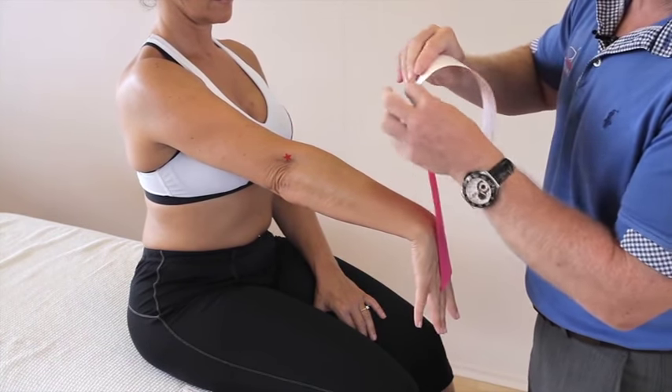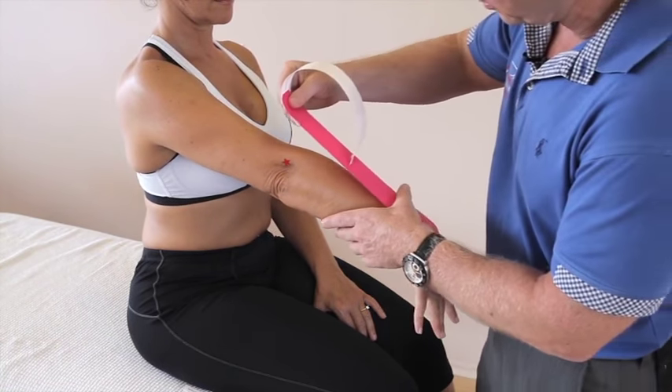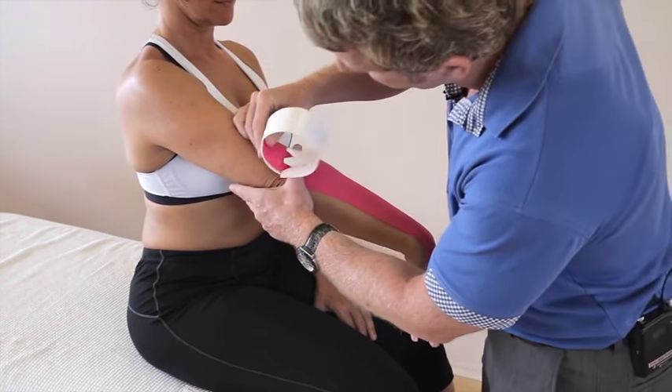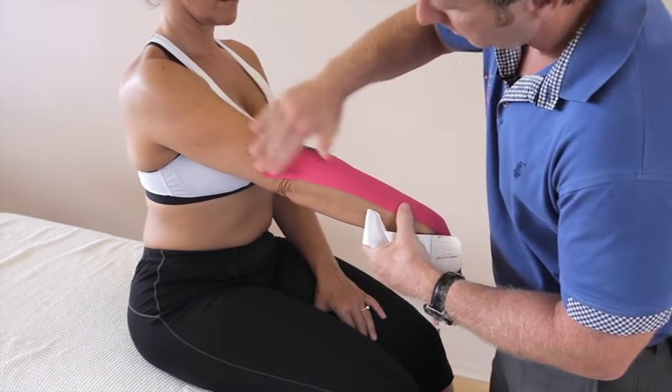Peel it back to the first square, then with just a little bit of stretch — about 10% — feed that on the extensors, and that should nicely cross the actual lateral epicondyle there.